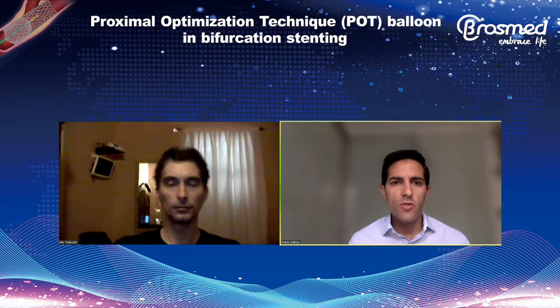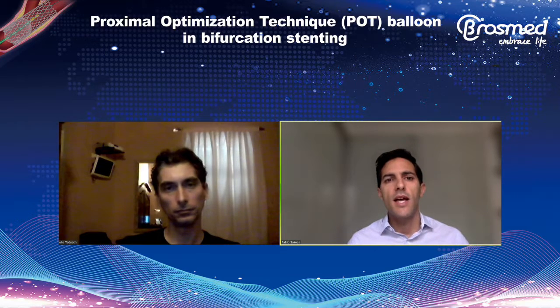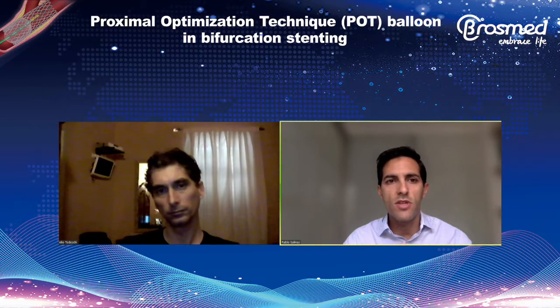A question from my side. We saw your beautiful images of stent enhancing. Do you trust the separation of the wires as the marker to place the distal marker, or do you inject and use the angiogram? Because I would maybe rather use angiograms if you are not really orthogonal to the bifurcation. What are your thoughts?